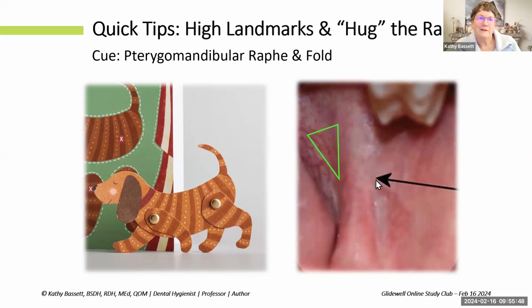The other little analogy that we use is be close to the raphe. Don't wander buccally towards the bone, just snug close to that raphe. Remember, it's flexible and moves like a clothesline. And we can actually manipulate it, but it's as if you were inserting into the depth of a taco. There's just this folded tissue, and just imagine you're aiming right for the bottom of that little taco shell. So at the dog leg, the bottom of the taco shell.